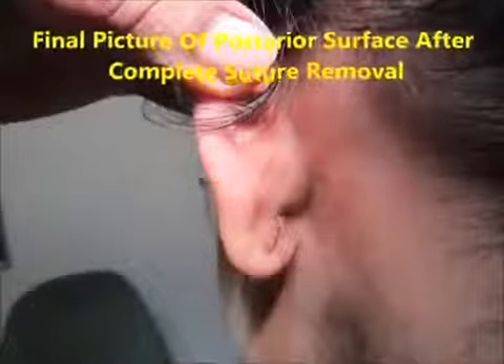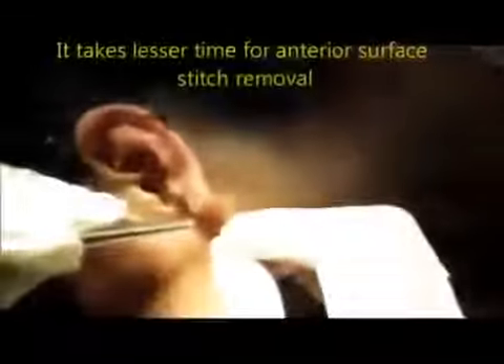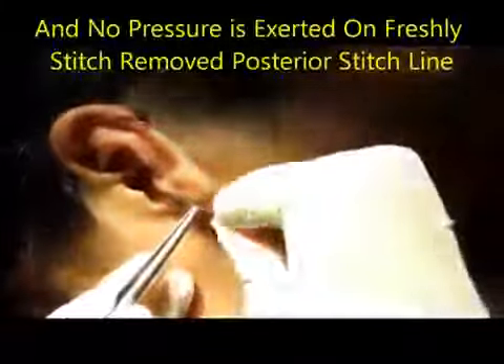You can see I have just finished the stitch removal of the posterior surface — one can see the posterior surface stitch line. Now I am coming to the anterior surface. Here I am removing the anterior surface stitches — no manipulation, no pressure over the pinna or the stitch line. This shows there is less chance of dehiscence.